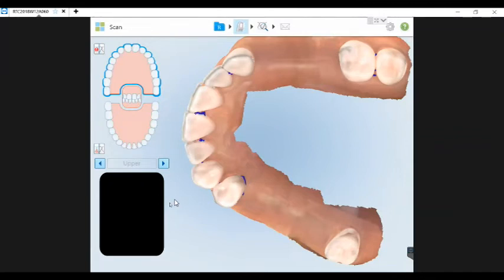Yeah, so the only experience that I've really had, Dr. George, is with an existing denture. So we'll take the existing denture and use a heavier body material where you would border mold. You could either do it in a two-step technique, or you could put the heavier body along the perimeter of the denture and then the lighter body on the intaglio, put the denture in place, and then have them go through their AIOU, everything that you would ordinarily do to create that border molding experience.